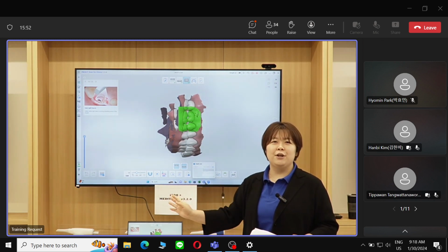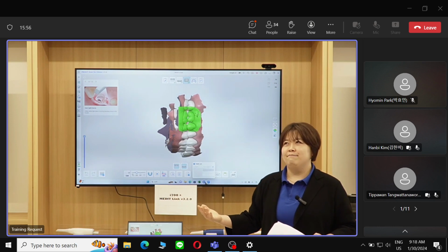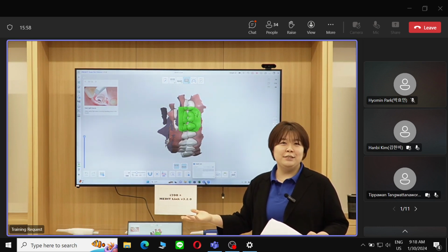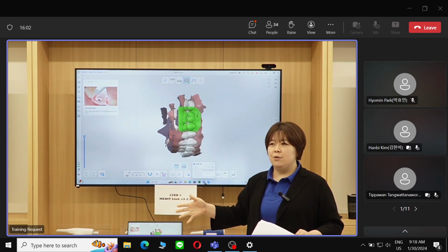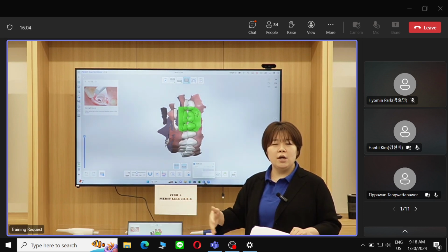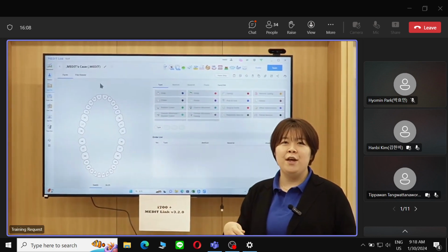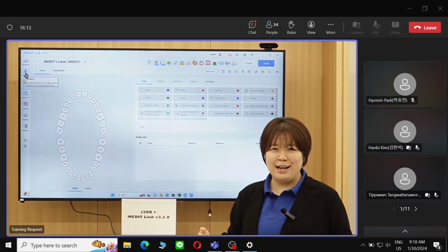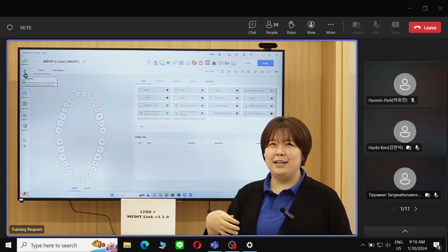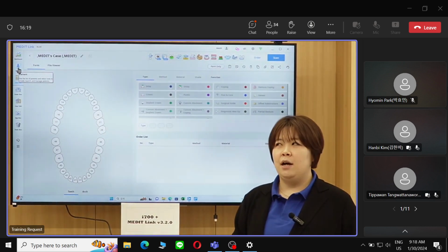So, their scanners are not as great, compared to theirs. But what we want to say is, really, in the context of the global exhibitions, we've seen their employees actually come to our booth and try out scanning with our scanners and actually learn ways to intentionally fabricate that double layering phenomenon.